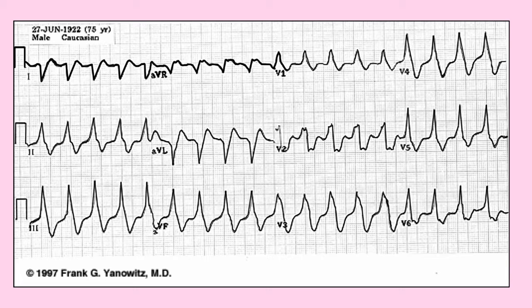If you look at the next slide, this is a 12 lead with VTAC. Generally, we can see VTAC even better just with the rhythm strip, but it can be caught on 12 leads too. So, wide, fast rhythm, ventricular tachycardia.